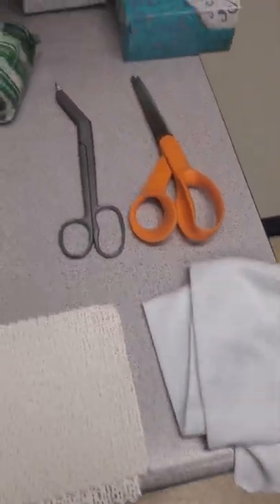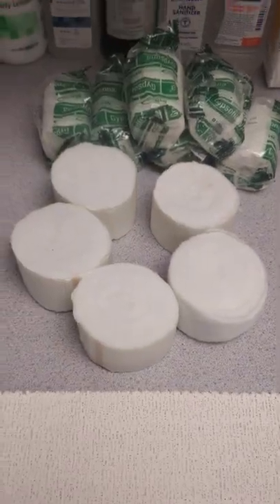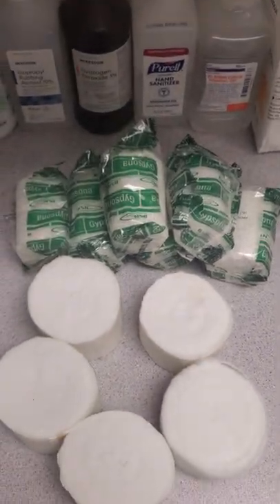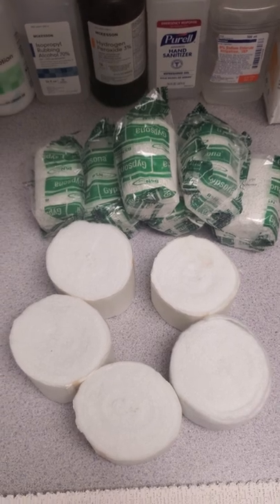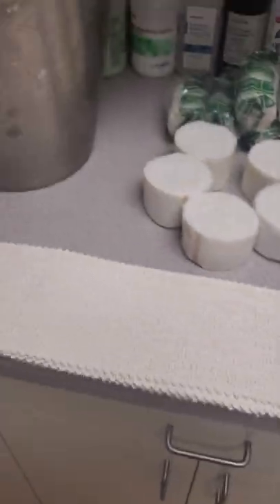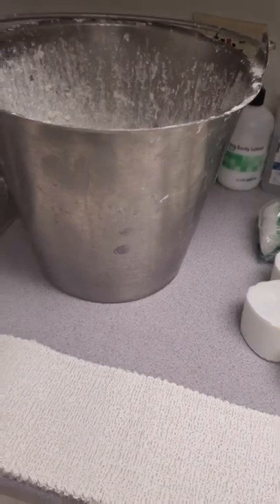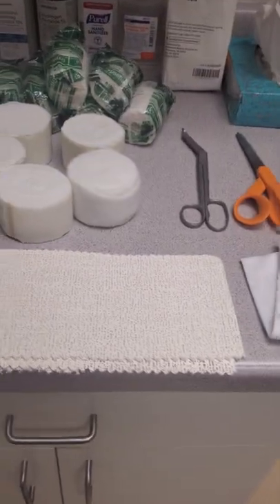Again, basic stuff: stockinette, a couple of different pairs of scissors for different reasons, some padding, lots of plaster. We have plaster rolls and we also have the plaster strips, just so I can show you a couple of different little methods. And of course, the old-fashioned plaster bucket — a mixing bucket — because we'll be using some warm water shortly.